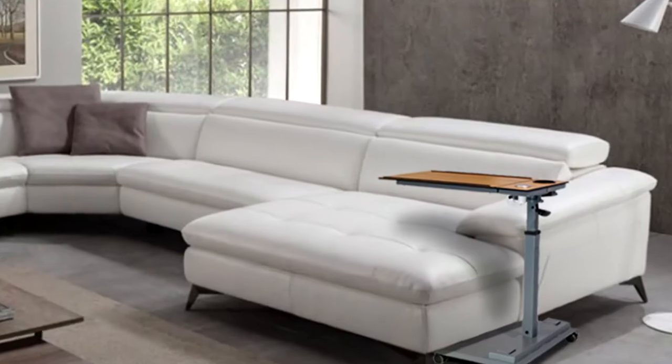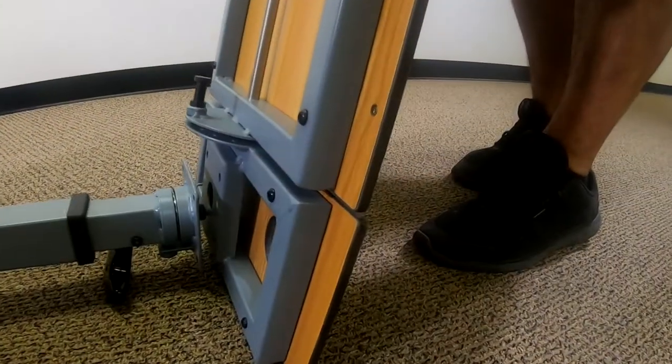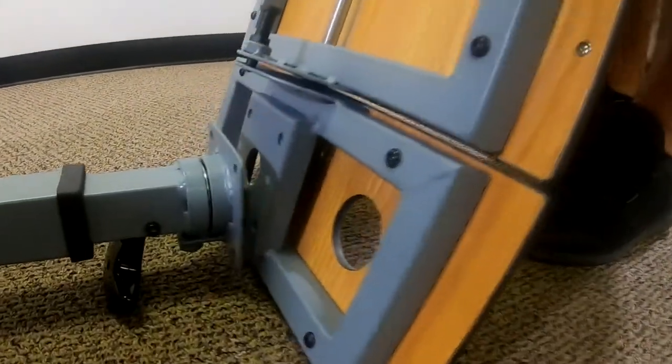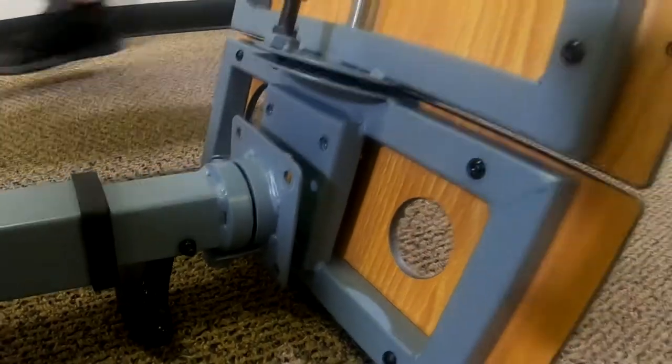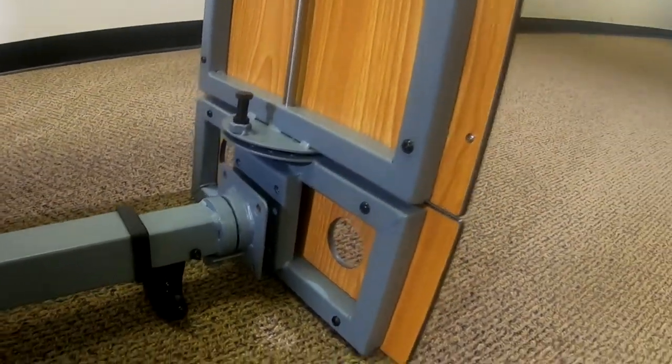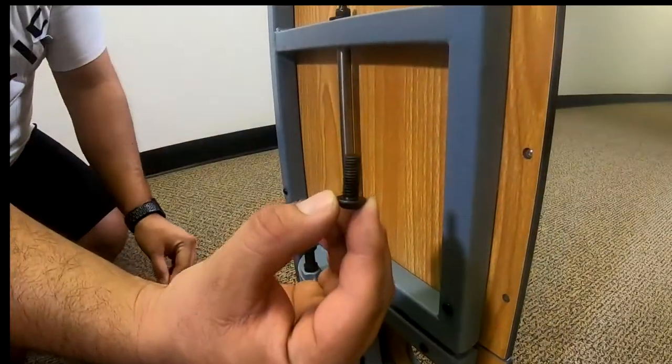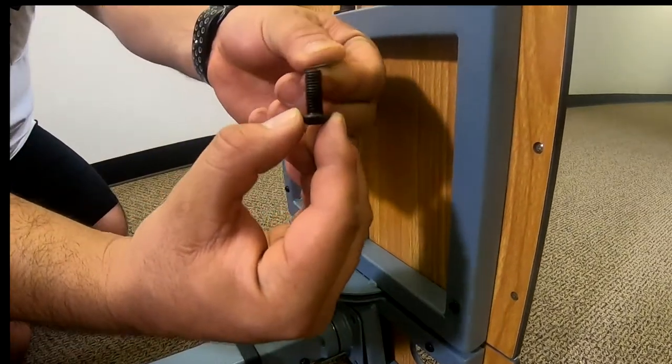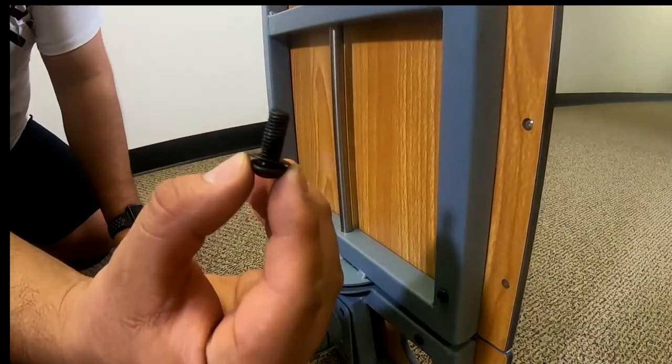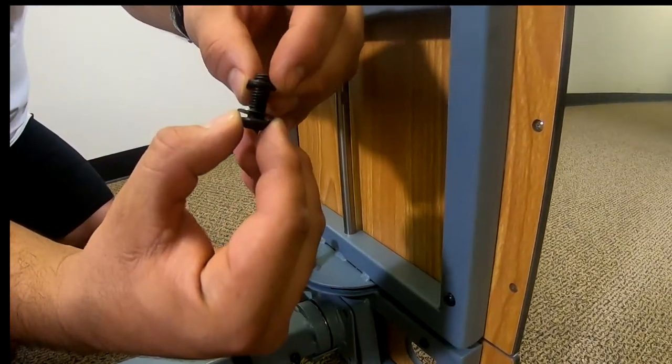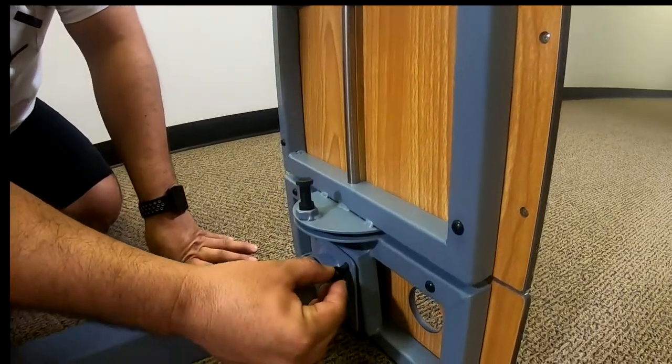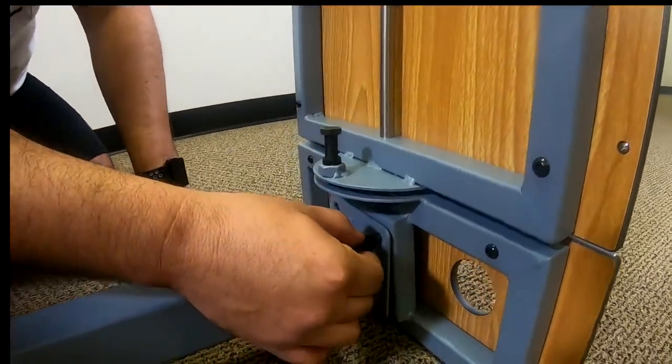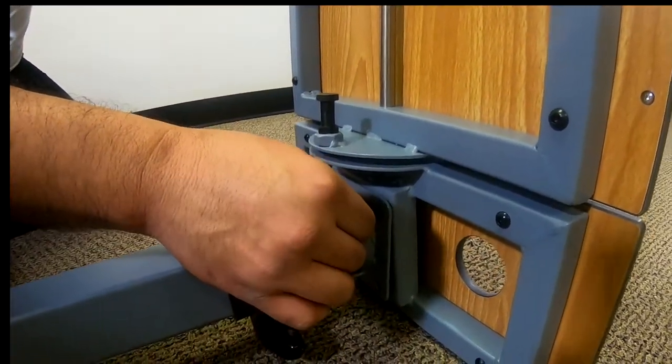Excellent! Now let's attach the table top. Position the table top against the top of the column. Using the table mounting hardware, place an M8 washer, followed by an M8 spring washer, onto the M8 bolt. Install the bolt through the bottom of the column to secure it to the table top.